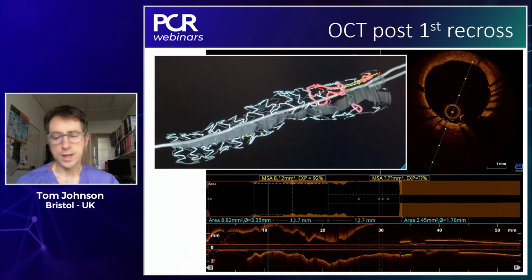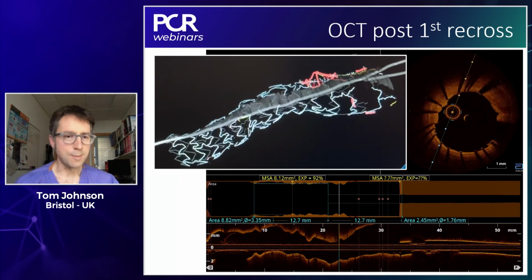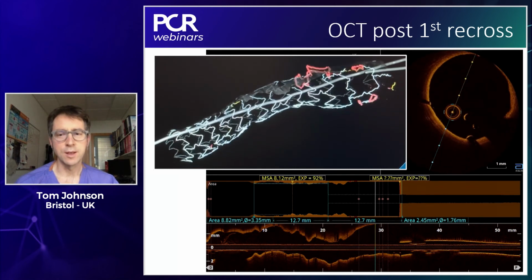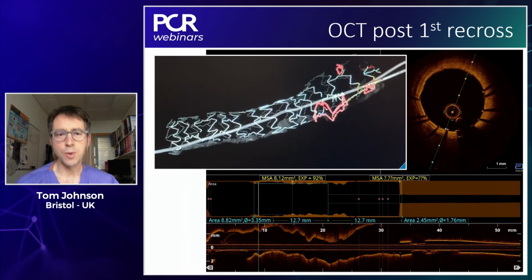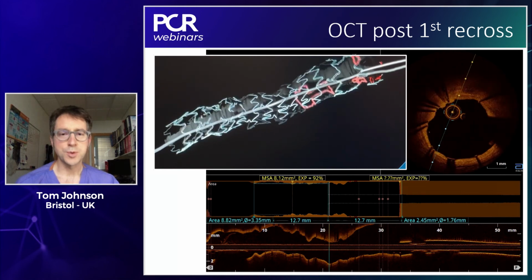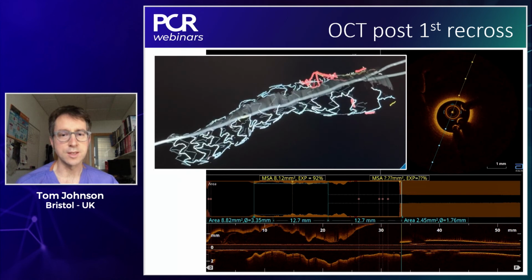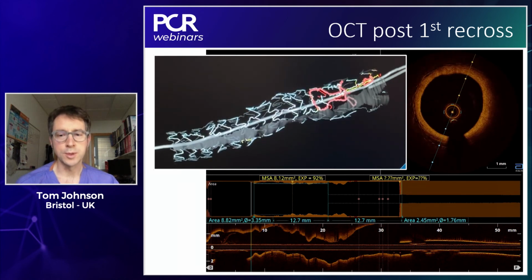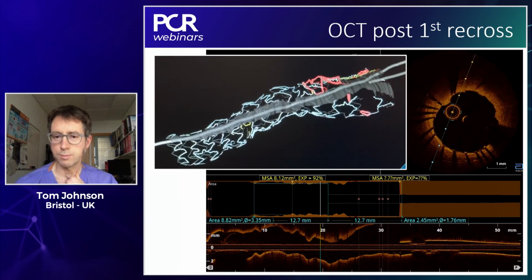And that would bring me back to Goran's point he made earlier, which is there's no potential penalty in kissing. I would argue differently. I think in the absence of using imaging, there may well be a penalty, because we don't know where the wire's crossing. And the subsequent KISS might result in us distorting the architecture of the stent in a way that is suboptimal. So I would always want to use imaging to better establish that.